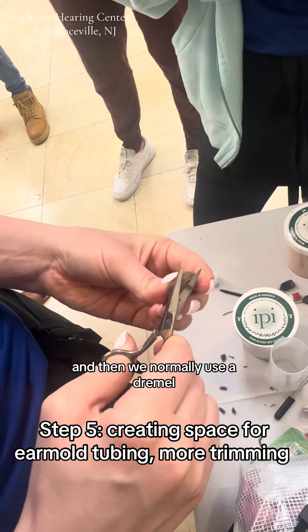Now I'm feeling where it is as I am pushing. See, we almost got it perfect — not quite — there we go. We know we don't want hers to go in that far; they're not going to do that. So we're going to start by cutting off the excess, and then we're going to start filing it down — and that's where the tube is going to come out. I start trimming here. So you're trimming it to de-bulk it from the outside?